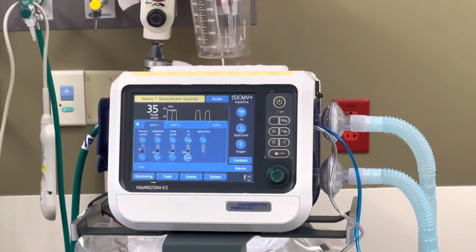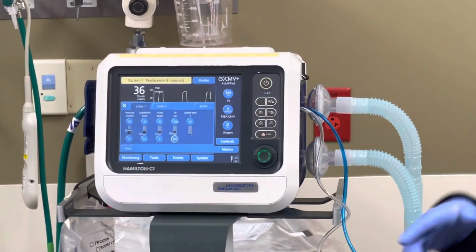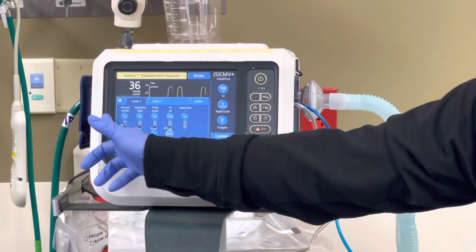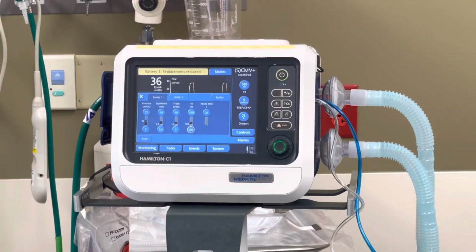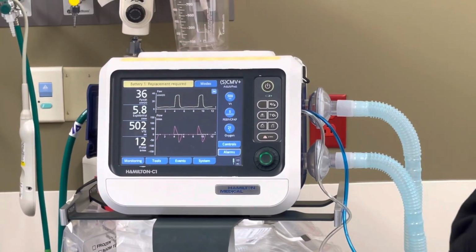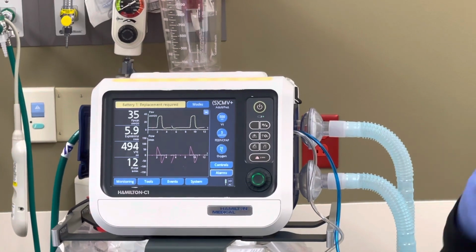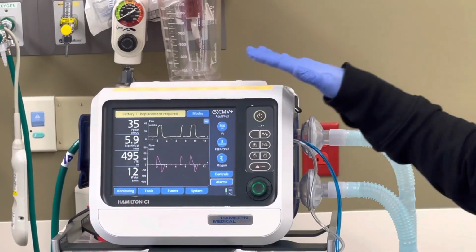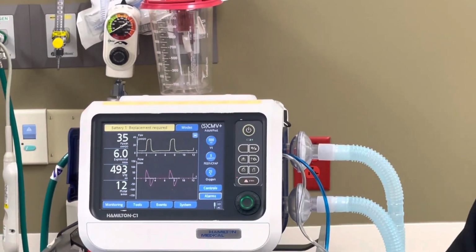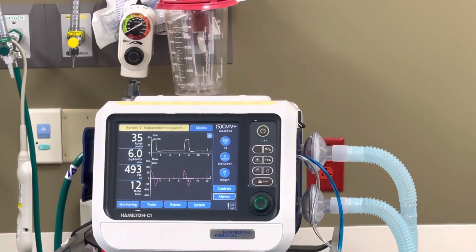But just to start, I wanna make sure I give them enough space to take a breath if they're taking a spontaneous breath. Also wanna make sure kind of where my alarm settings are. If I'm having to go too high on my peak pressure, saying I'm hitting around 60, then it could be either sedation's an issue, like if the patient's fighting back against the vent, or it could be a lung issue, meaning that I'll either need to change the mode on the vent to try to help with those higher peak pressures. Does that make sense? Any questions?